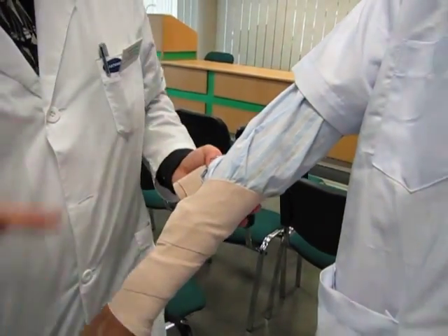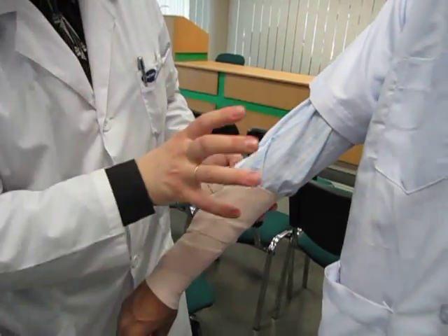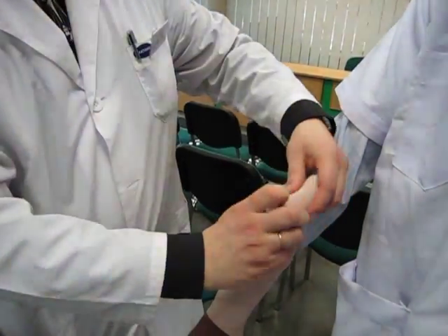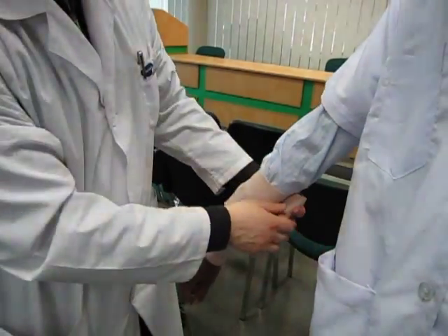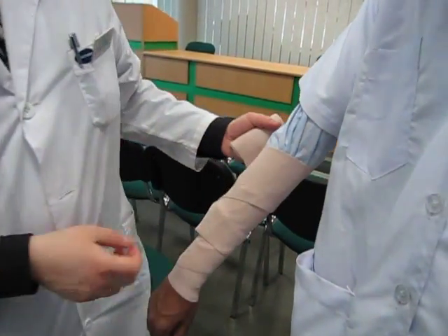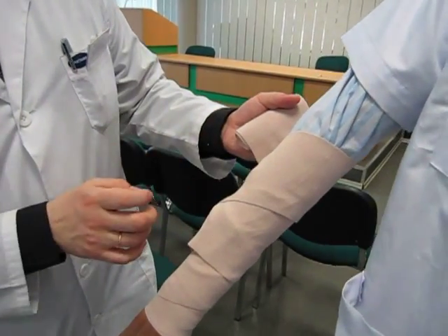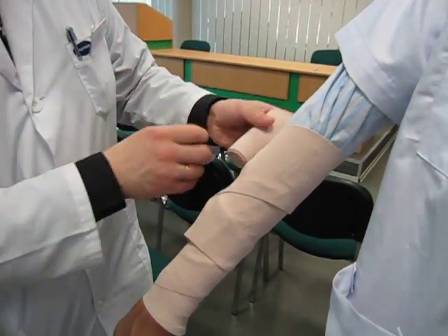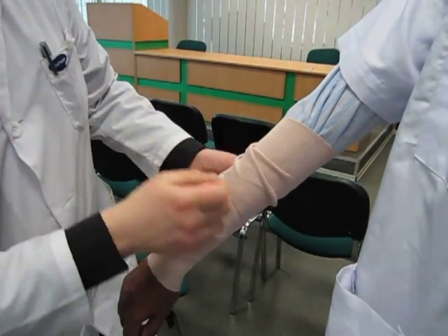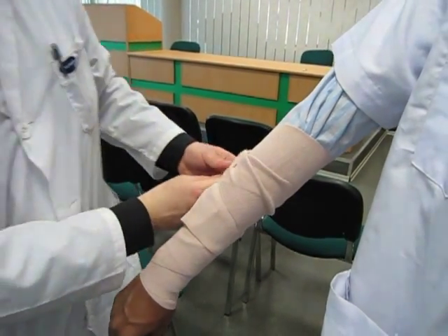The third rule is rolling the bandage on the skin surface. It is impossible to form the bandage like this — it is impossible. Why? Because our roll of bandage can fall down and we cannot control the bandaging normally.